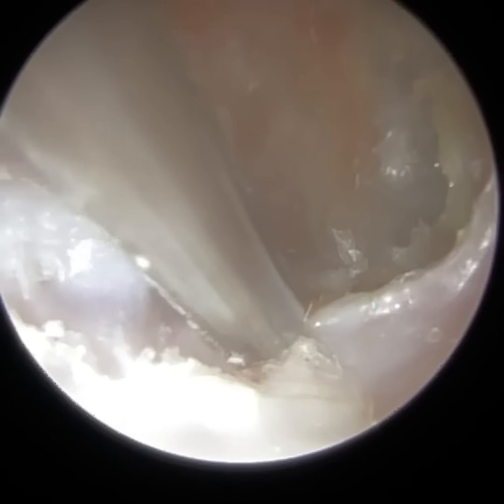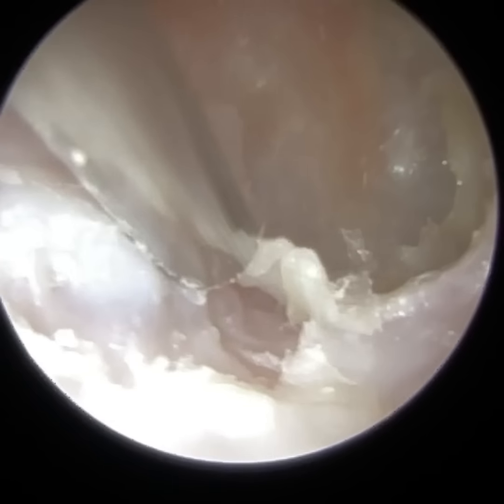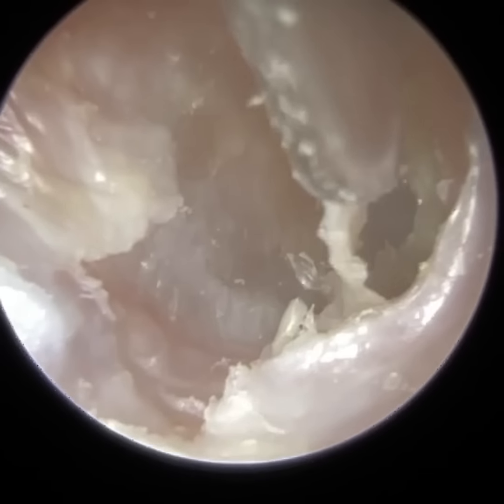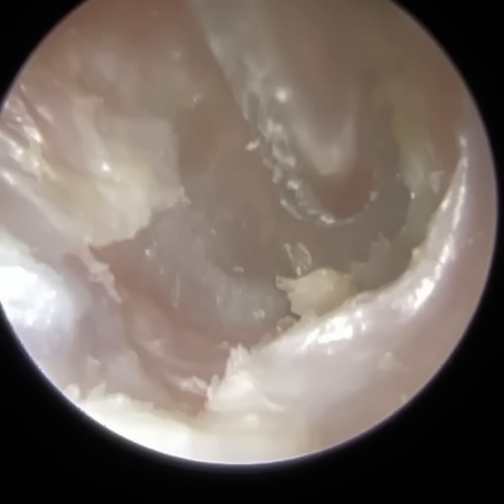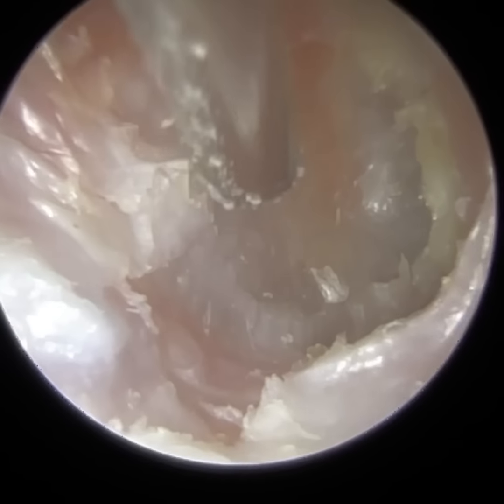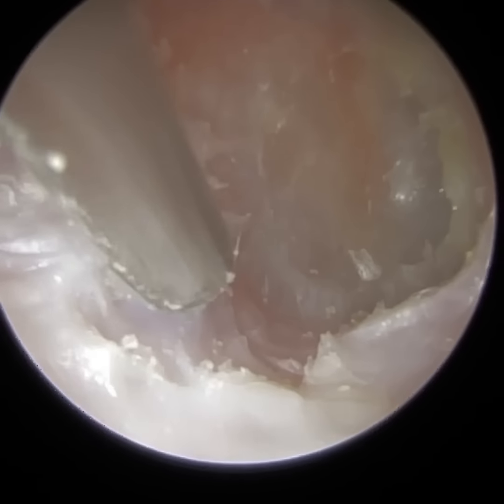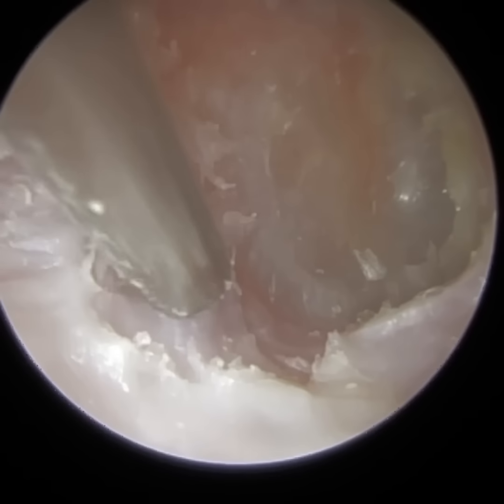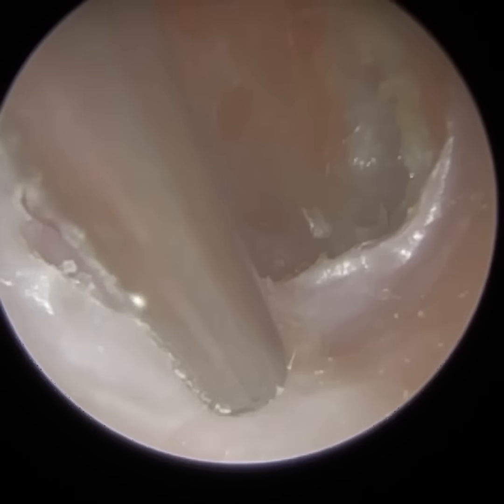This is the section I was really concerned by, because I just don't know how thick this skin is, and I dread poking into the floor of the ear canal and the bony part with the fine end, so I'm playing it quite cautious here. So already the patient can hear significantly better. Here I just wanted to make sure there's no canal cholesteatoma. It's kind of a good spot for canal cholesteatoma, that is.